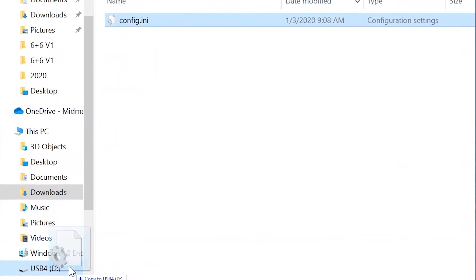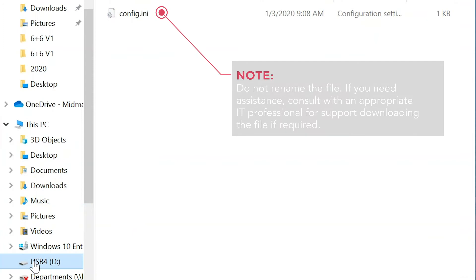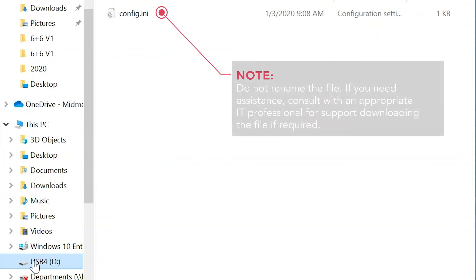Make sure the file has been successfully copied to the USB device. Do not rename the file. If you need assistance, consult with an appropriate IT professional for support downloading the file if required.